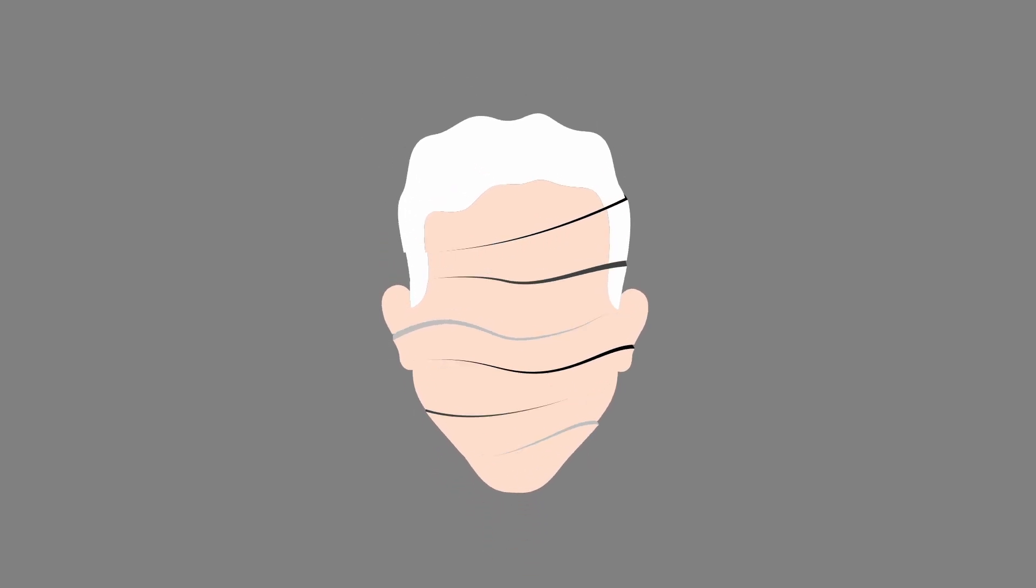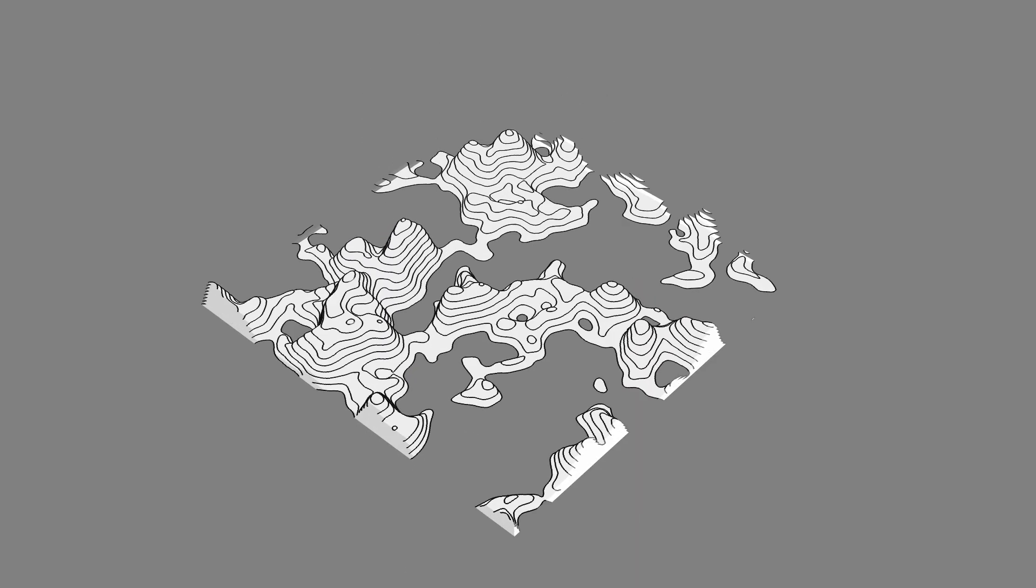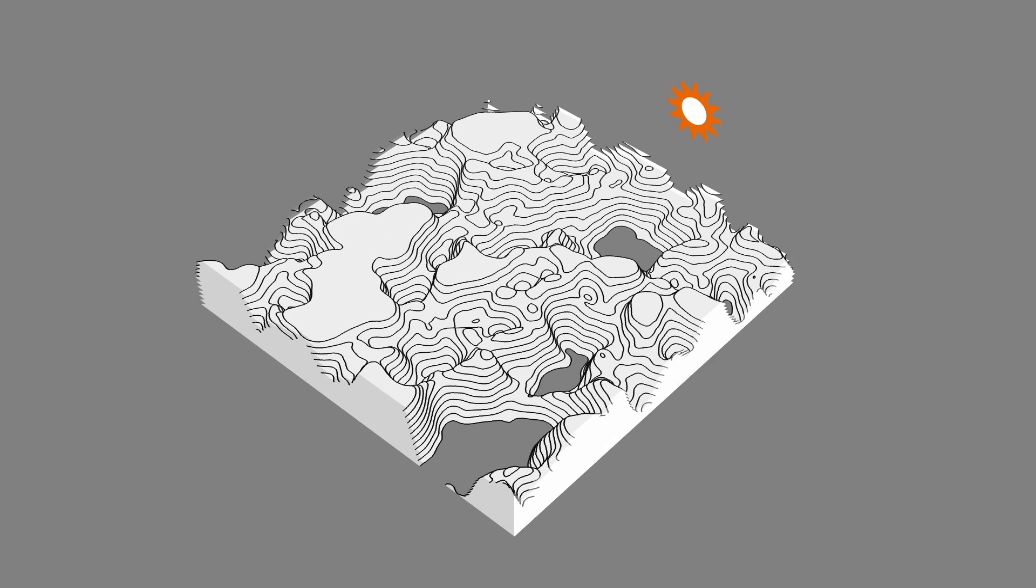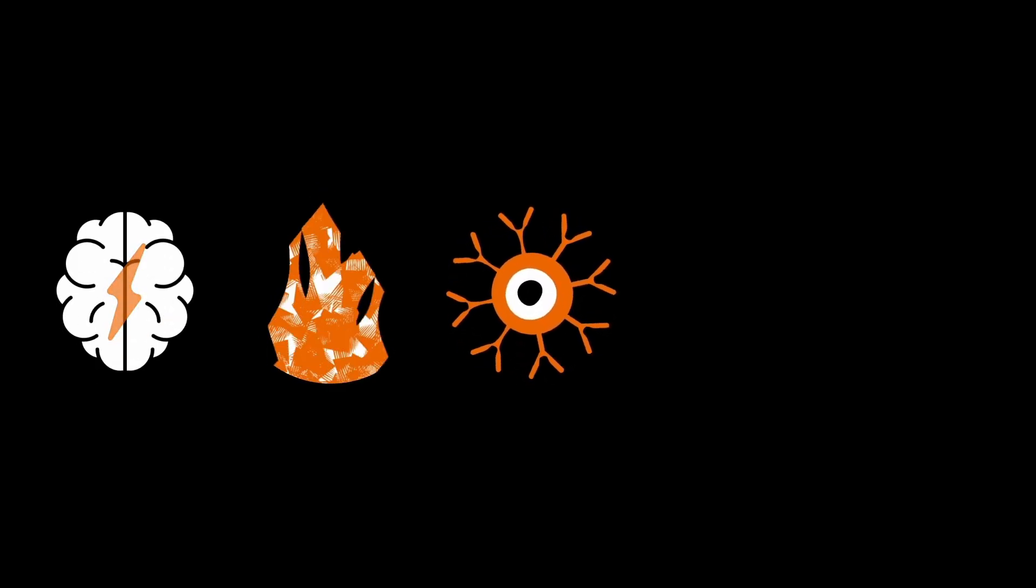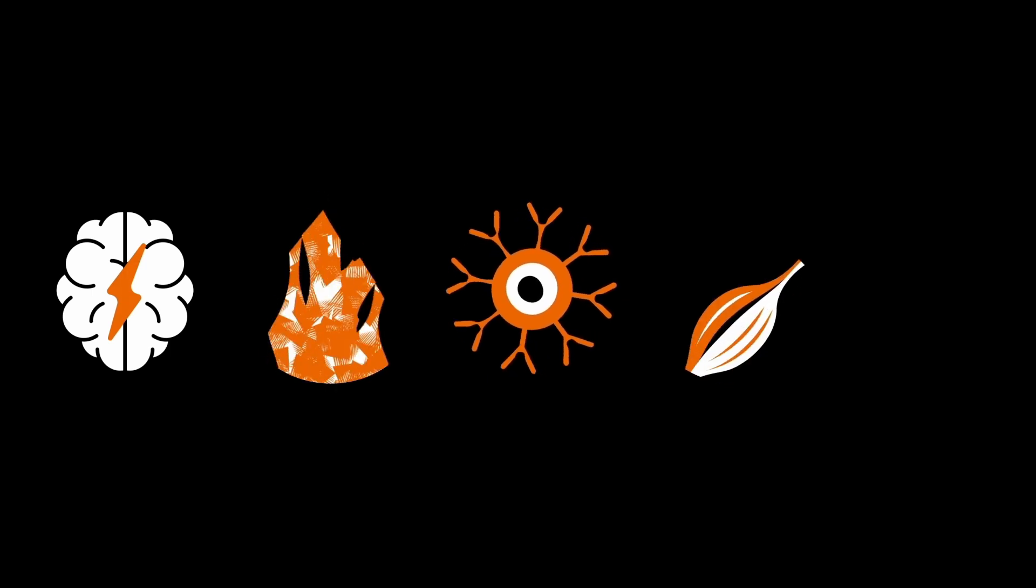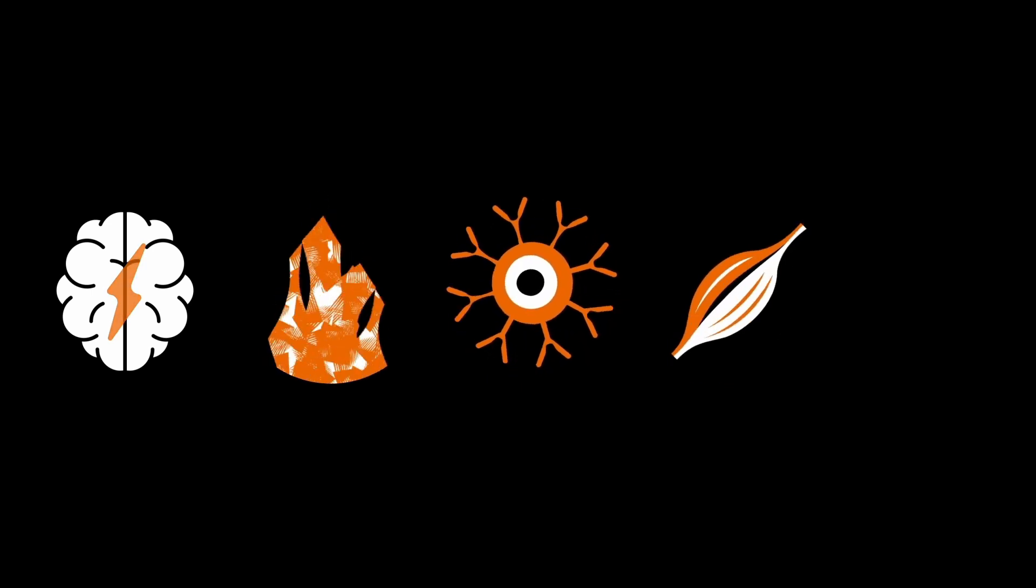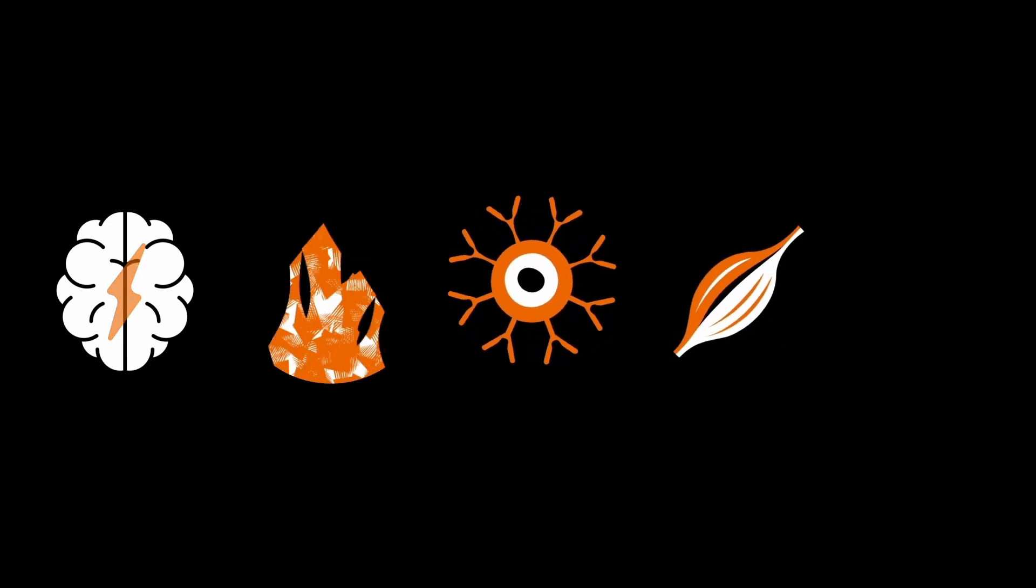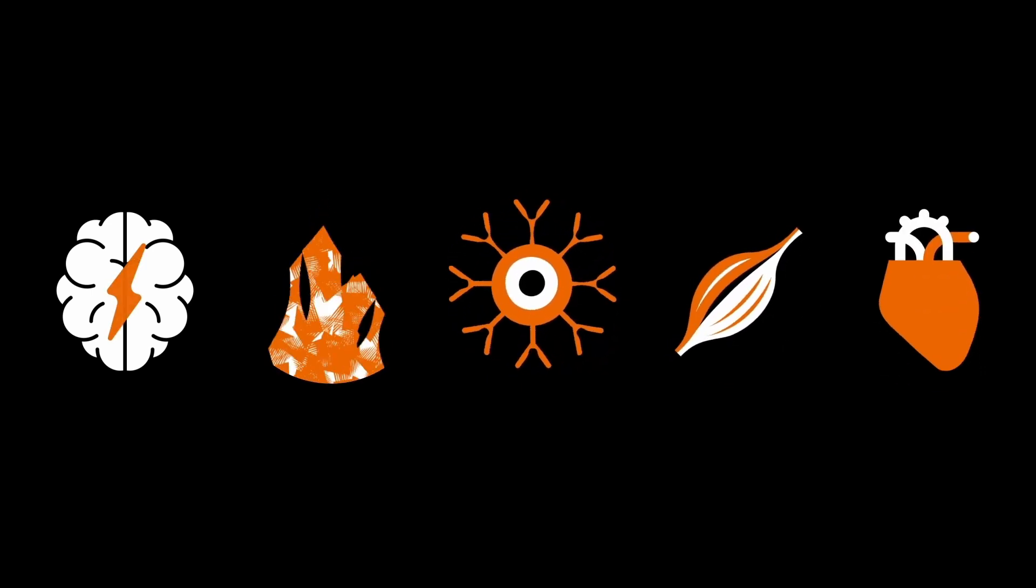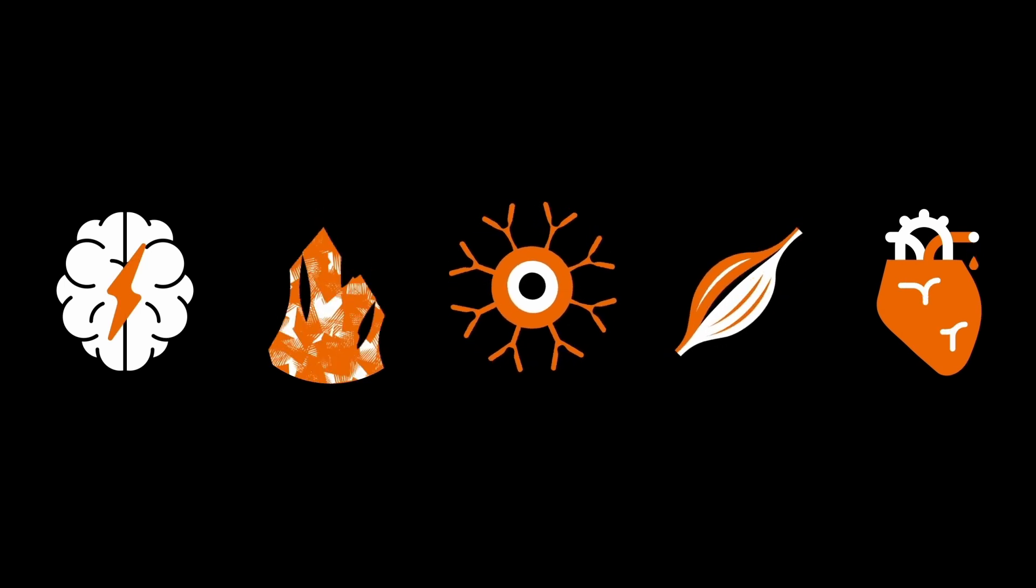An MRI machine produces sectional images in any spatial direction. It can be used to visualize strokes and inflammation, cancer and damage to muscles, sinews and tendons. Another specialty is imaging blood vessels and the heart.